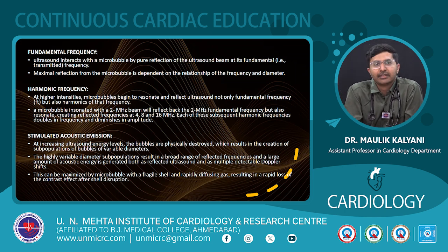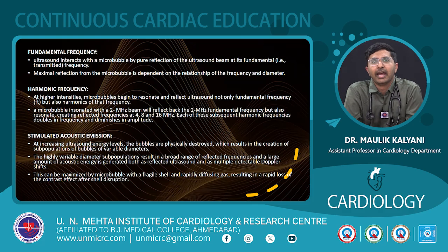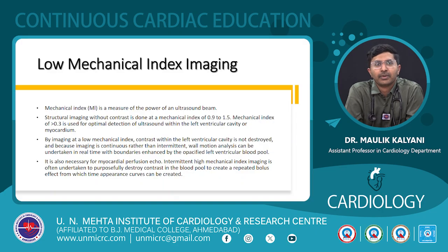Stimulated acoustic emission occurs when you increase the energy level. This results in the bursting of these microbubbles, and with this burst, a broad range of frequencies and a very high intensity of acoustic energy is released, which is also picked up by our Doppler signal.